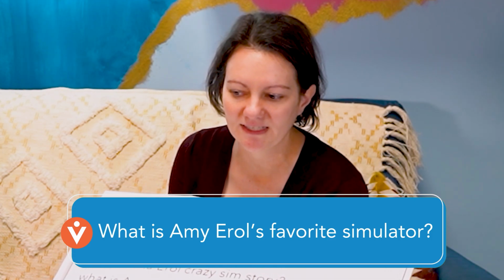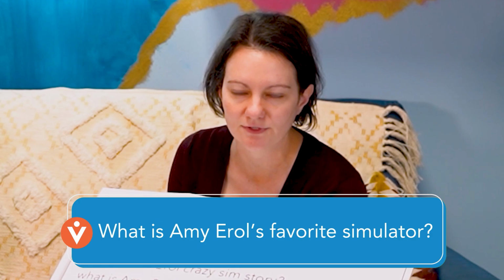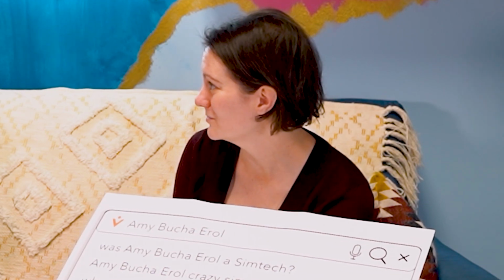When we first started the company, we released the trach, and then we released the cath and the stick pretty shortly after. With the stick specifically, we really struggled at the beginning with finding something that worked well for the customer and was really easy to use. Whenever you have pressurized fluids in a system, it just becomes really complicated. And we needed it to look nice. We needed it to be able to get blood all over it and still be usable afterward, because some students, when they stick it, might have a little blood come out. Because that happens sometimes. So we had a lot of iterations with the stick.